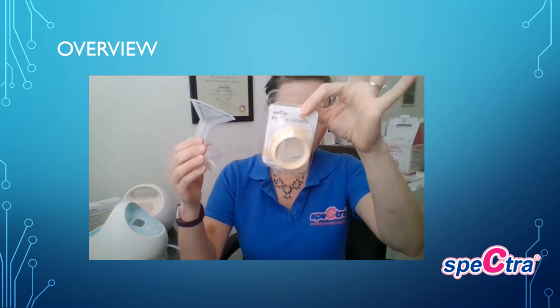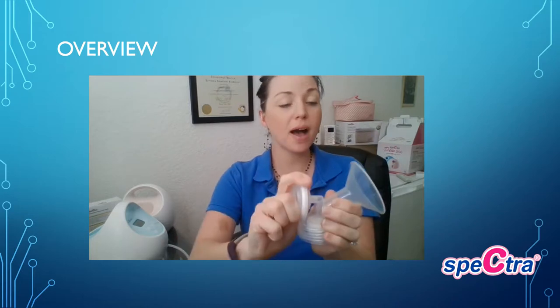You have your flange — it is a wide neck. Your duck bill valve fits on the bottom just like that. We do offer a converter that can be put at the bottom of the flange to be compatible with any narrow neck bottle. For your backflow protector, you want to take the silicone portion and put it on the smaller piece. You have the three pieces, so on the smaller portion ensure that it properly fits all the way around.